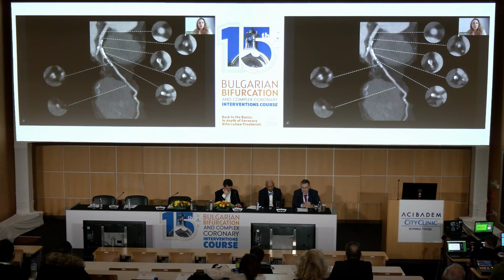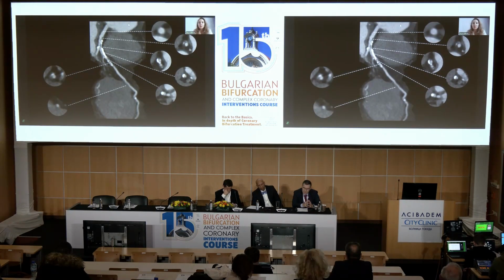If we want to take a deeper look in the characteristics of our plaque, we see our proximal reference diameter, which is with a normal vessel. Then we see the start of this lipid plaque, lipid component, low attenuation component of our plaque in the left main going to the ostioproximal part of LAD, and then this dense calcific plaque in the proximal part of the LAD.